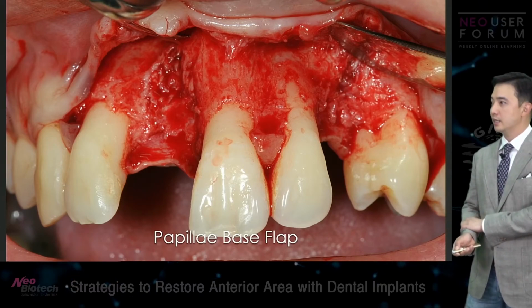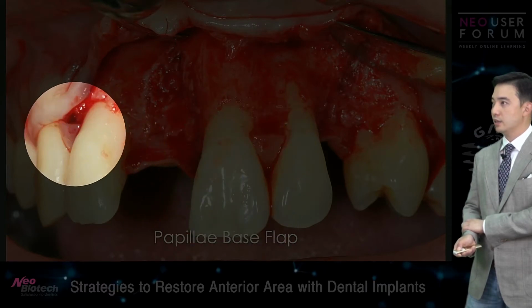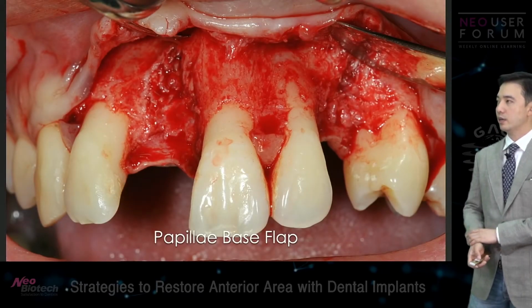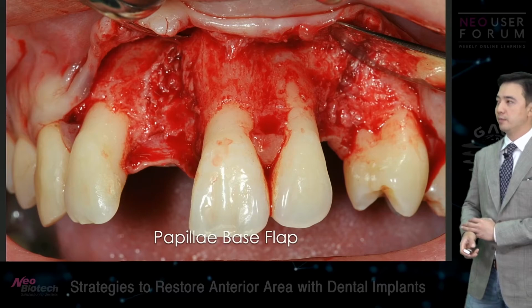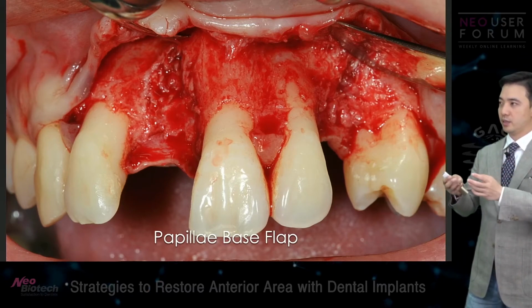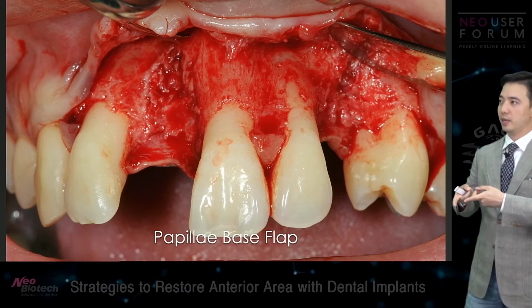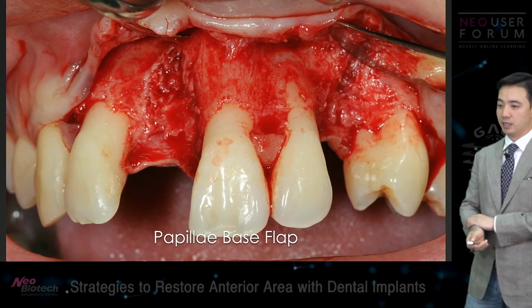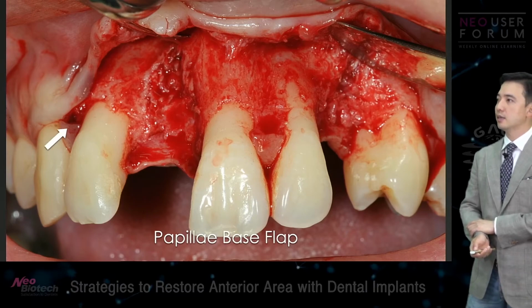Notice I did papilla-based flap here and here and here. So according to the literature, when you do a papilla-based flap, compared to a conventional flap where you incise through the papilla, this has really fast healing and minimal scars and all that. Okay.